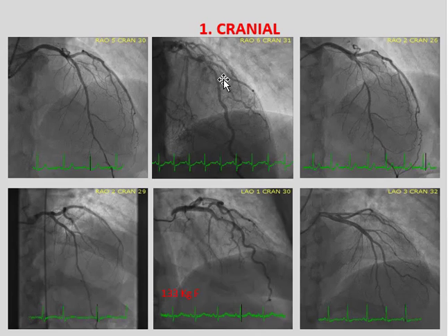If you imagine you have a pencil in your shirt pocket over your heart, by looking at the heart slightly from your right, with your head tilted forward, that pencil will go slightly from the top left-hand corner to the bottom right, in a diagonal. That's the easiest way I can explain the cranial view. You can memorize it, but you can always check it by looking at your chest and imagining a pen there. You have to tilt your head fairly forward to get that angulation, otherwise the pen will appear straight.